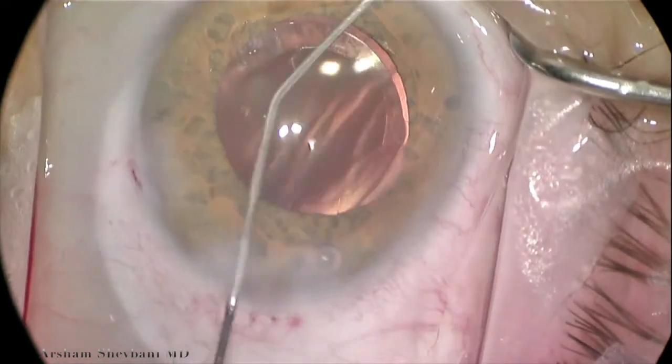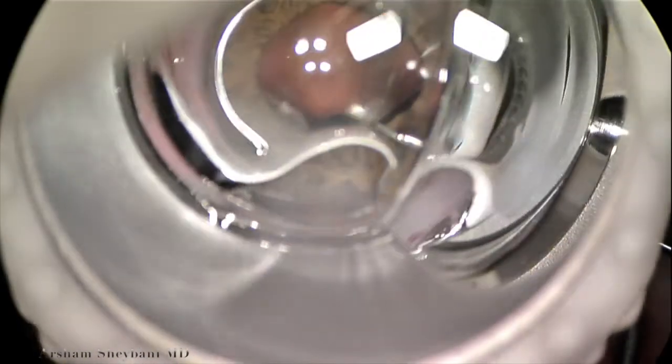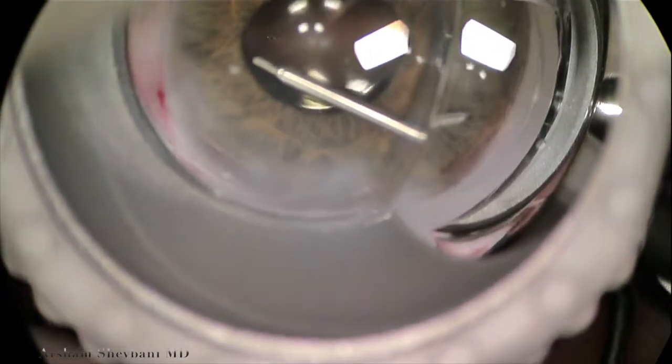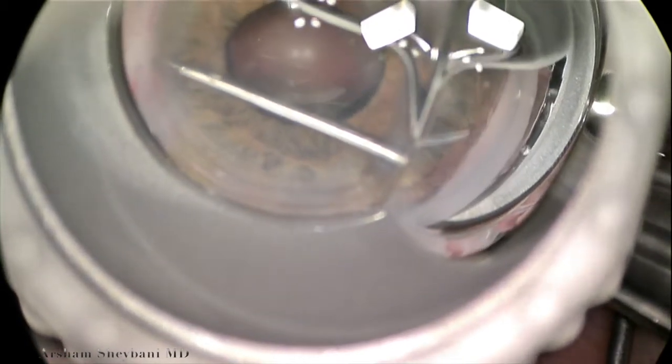After phacoemulsification, we will sweep miochol against the iris in order to constrict the pupil. We then use 23-gauge micrograsping forceps. If you look at the right side of the video, you'll see that you're looking through the mirror of the single-mirrored gonio from Katina.